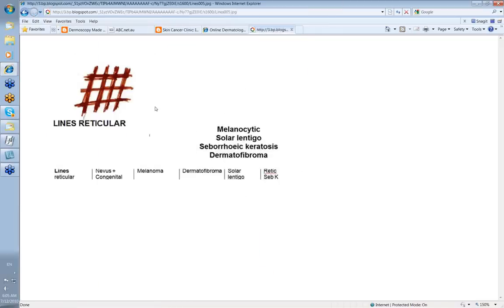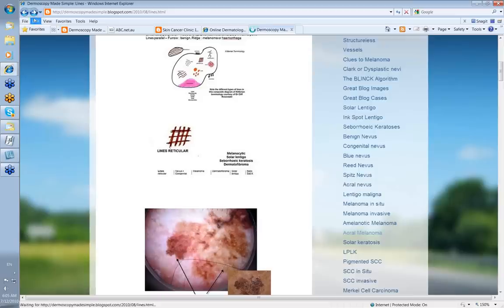Just a summary again of lines reticular — generally melanocytic, either a nevus, congenital or otherwise, or a melanoma, or a dermatofibroma, which isn't really a pigmented lesion — it's only reactive pigmentation on the surface. Also solar lentigo or a reticulated seborrheic keratosis. Let's look at some examples.